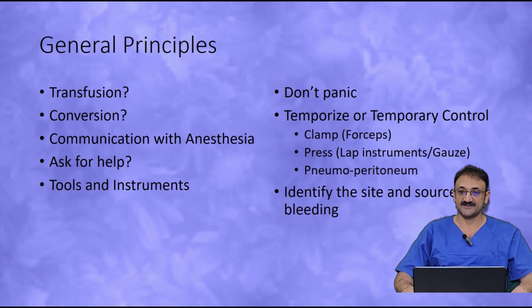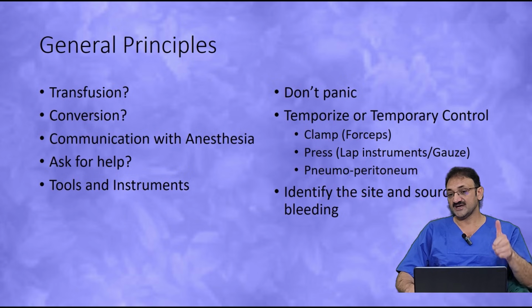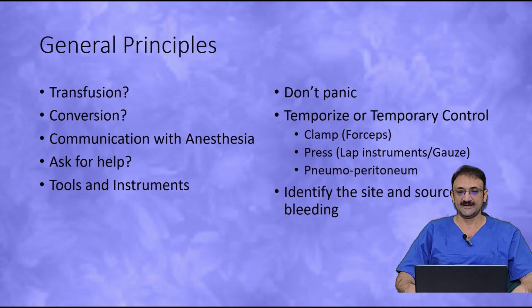If it is aorta, just grab that site and immediately convert the patient. If IVC, if you have an experienced hand, you can repair. If the tear is small, the hole is small, you can repair it. Otherwise, you have to convert. So identification of the site, and for that you need to clean that area with a suction, and then you will be able to see what is it that is bleeding. So these are the general principles.